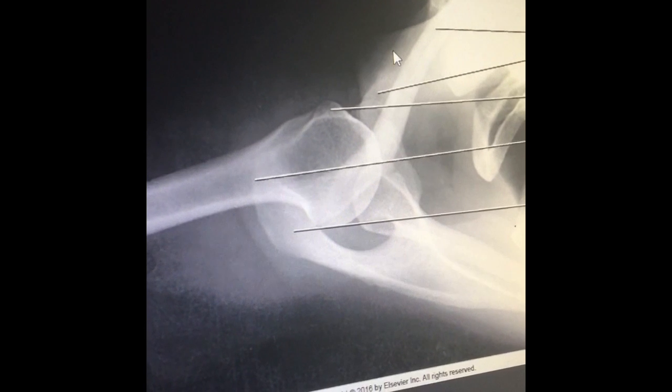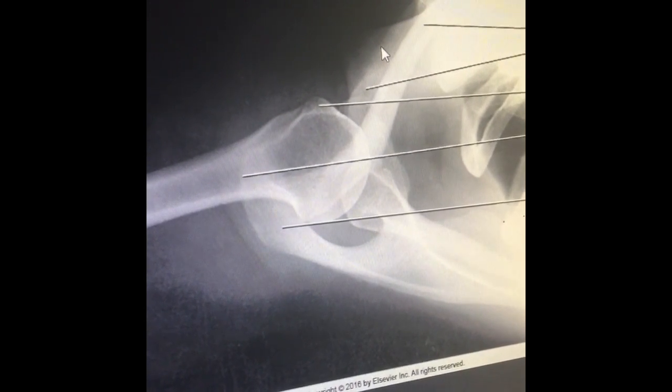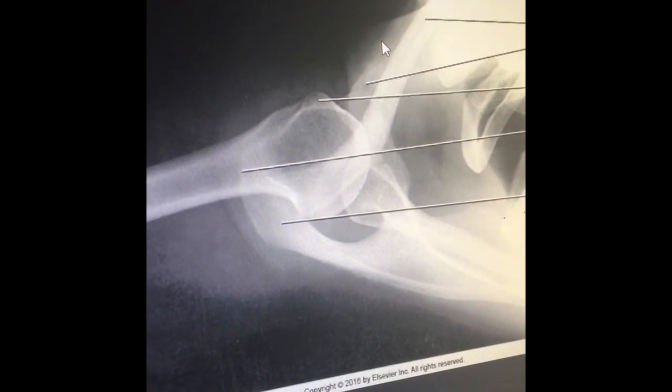And then soft tissue in the axilla with bony trabecular detail visible. And for this projection, we're actually using tabletop, so our technique would be decreased to a 75/5 technique. And this concludes my shoulder trigger.